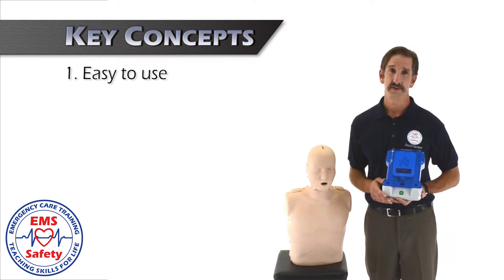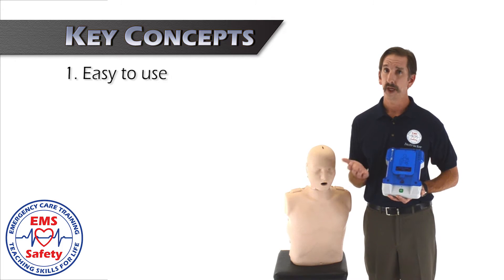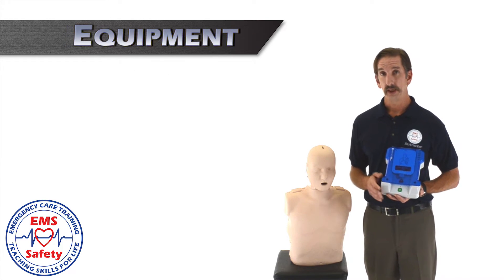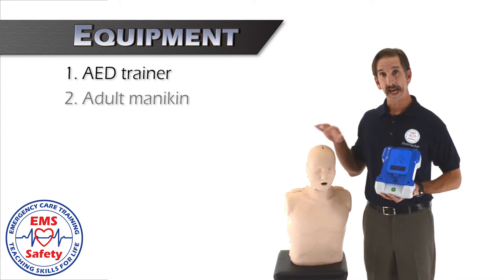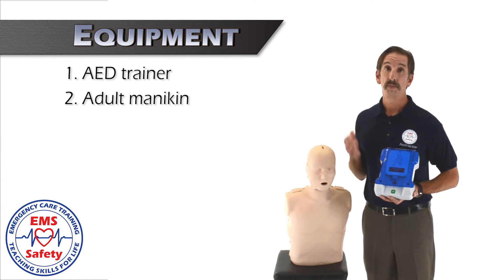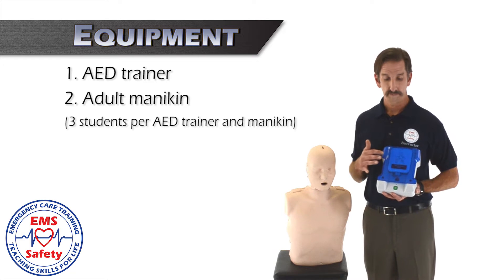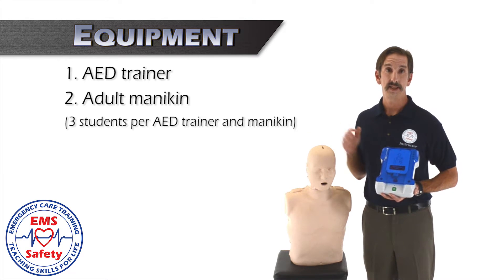AEDs are easy to use — just turn it on and follow the prompts. They can be used on adults, children, and infants. To demonstrate the AED, you'll need an AED trainer and an adult mannequin. When you practice, we recommend setting up your students about three or four for every AED and adult mannequin that you have.